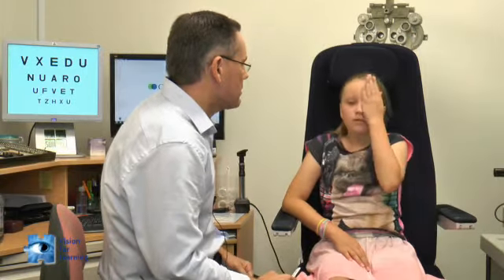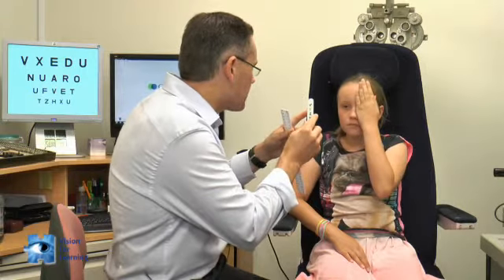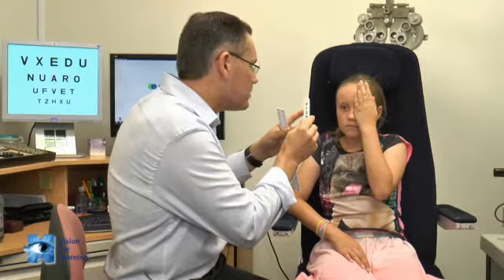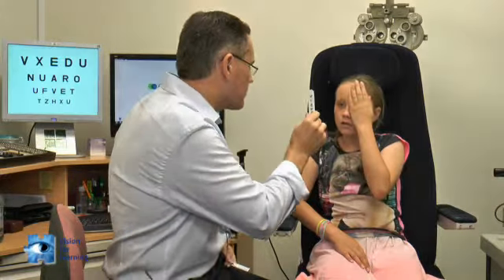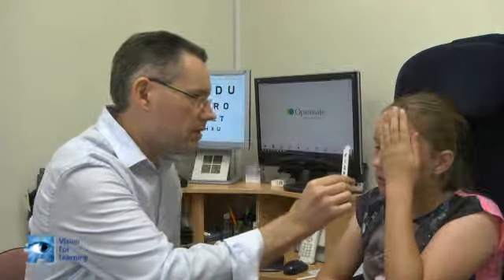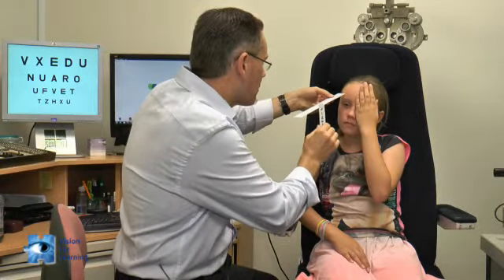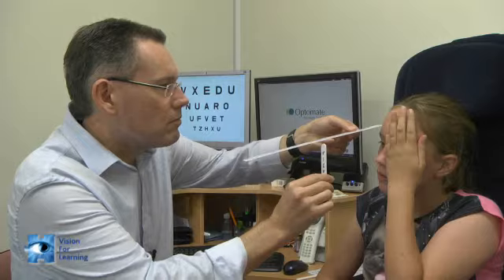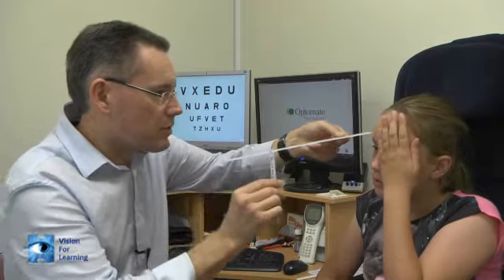Jessica, I want you to cover one eye now with your hand. That's great. Jessica, I want you to look at these small letters here at the top of this target, and I want you to tell me when you first noticed them going blurry. How are they looking now? Are they looking okay? Still good? Yeah. Still good? No, they're blurry. Blurring there? Great. And I'm just going to do it again. Tell me when you first noticed them going blurry. Now. Great. And again, when you first noticed them going blurry?